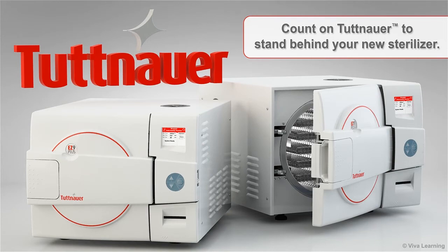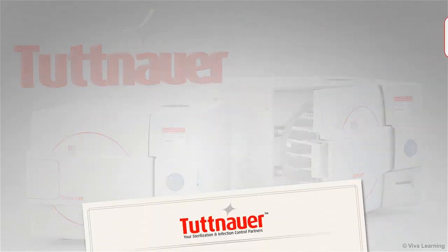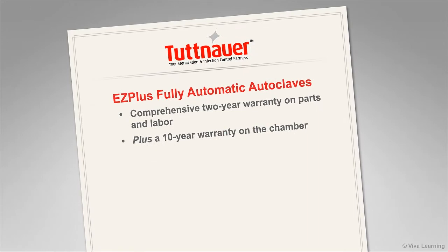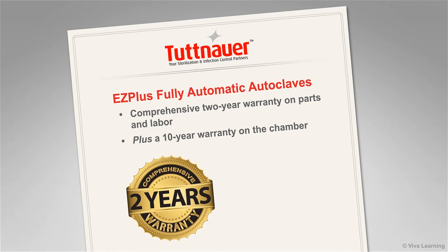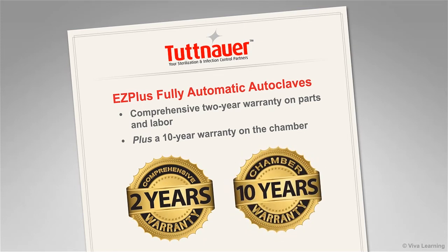Of course, you can count on Tuttenauer to stand behind your new sterilizer. As with all Tuttenauer fully automatic autoclaves, the EZ Plus autoclaves come with a comprehensive 2-year warranty on parts and labor, plus a 10-year warranty on the chamber itself.